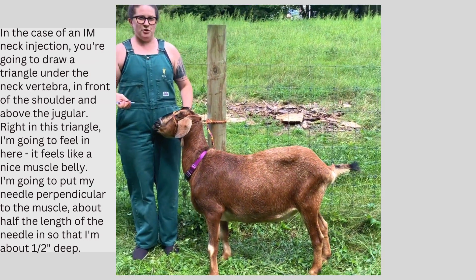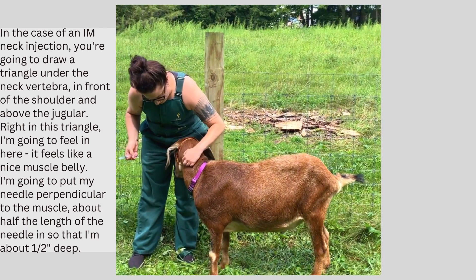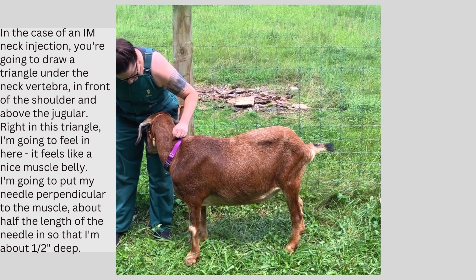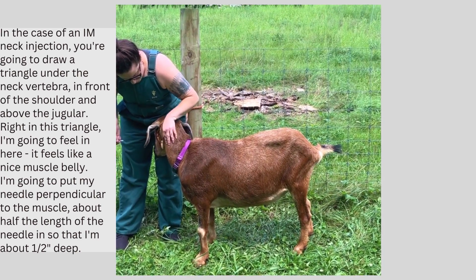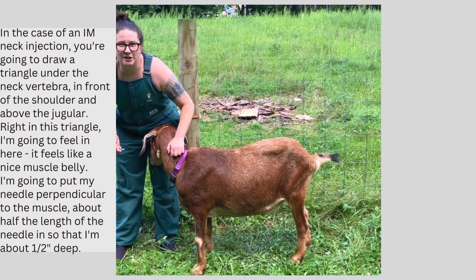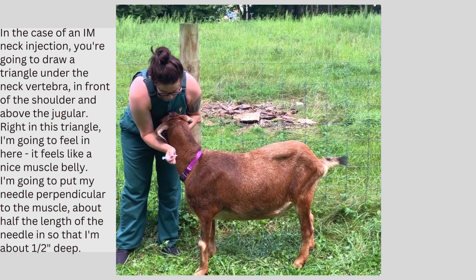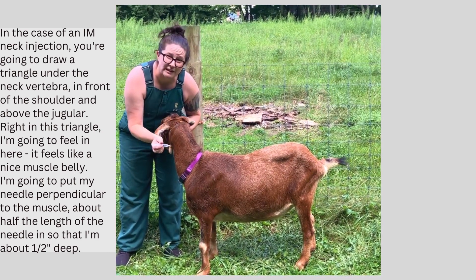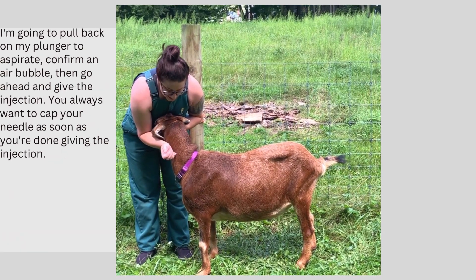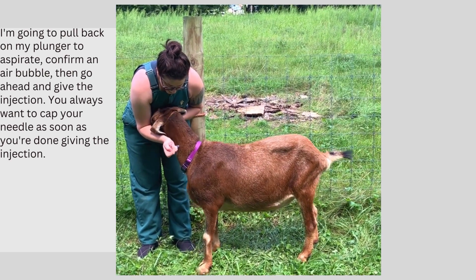In the case that you're going to do an intramuscular neck injection, again you're going to make that triangle above the jugular, in front of the scapula, and below the neck vertebrae, right in this triangle. I'm going to feel in here — this feels like a nice, good cushion of muscle. I'm going to put my needle perpendicular to the surface of that muscle, about half the length of the needle advanced, right like that. Then I'm going to pull back on my plunger, aspirate, and go ahead and give the injection.